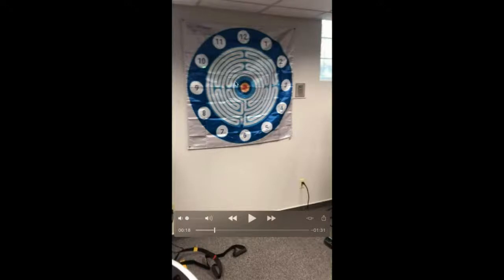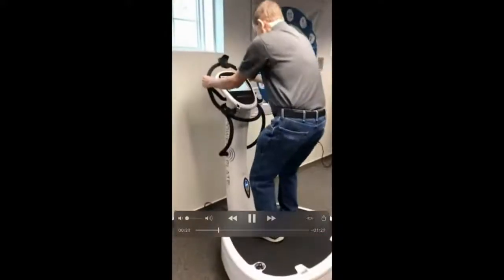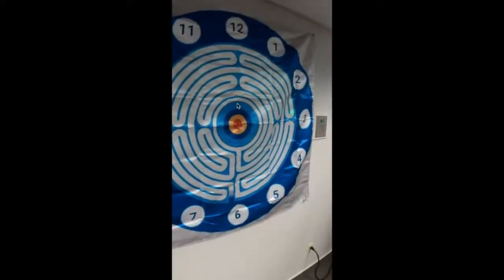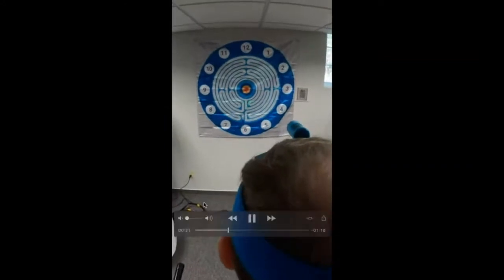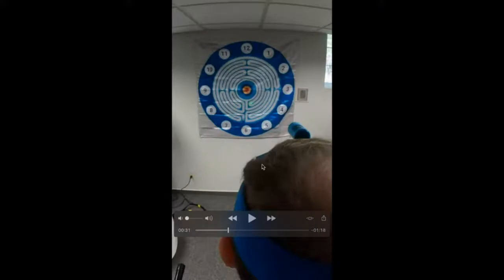He's also going to show a person working through the maze with this particular setup here. So you'll see the target move back and forth on the clock, and then moving around the maze. So what I am seeing personally with my, if I pause this for a second and just give a little bit of extra input, with my orthostatic tremor, she didn't want her video up here, so I respected that.